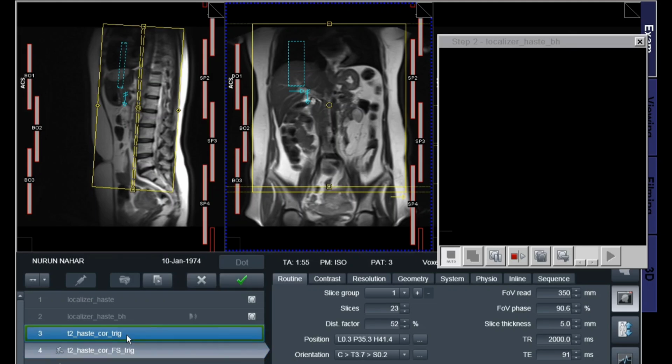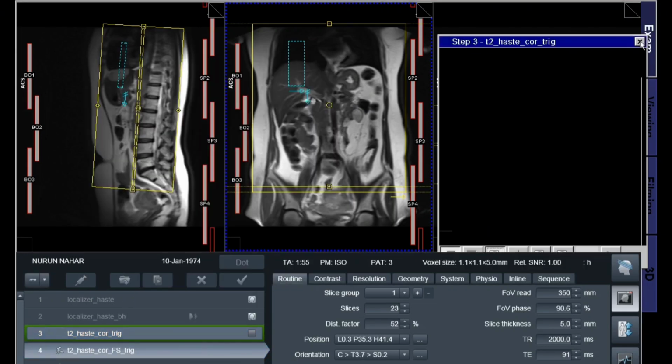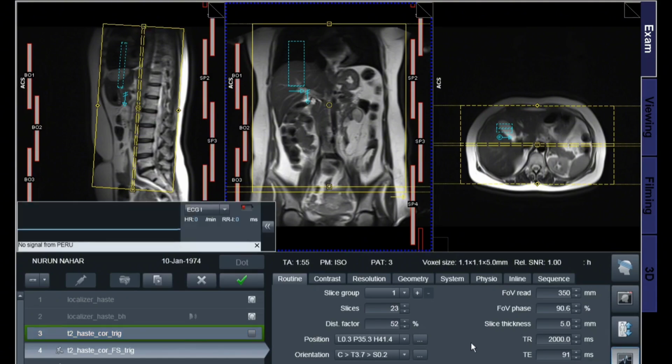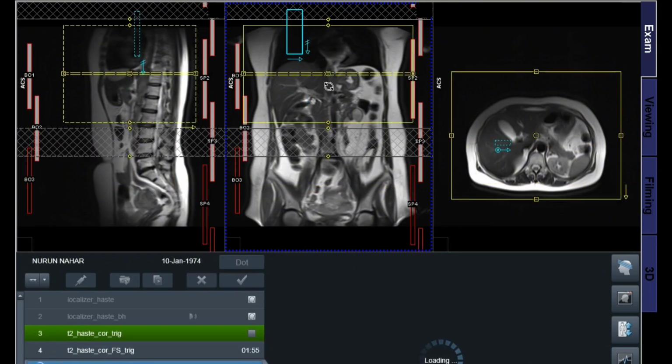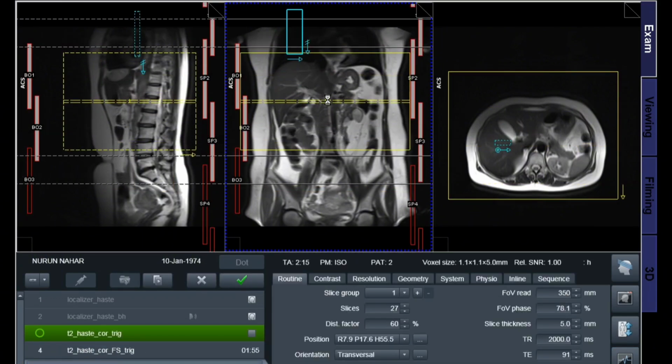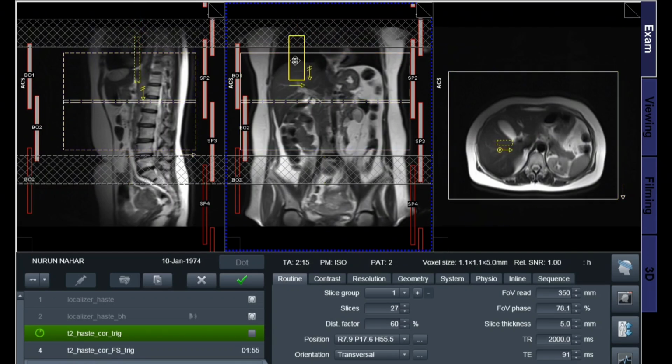What is MRI HBS? MRI HBS is a non-invasive imaging modality used to evaluate the liver, gallbladder, bile ducts, and pancreas. It uses strong magnetic fields and radio frequency pulses to produce high-resolution images without using ionizing radiation. MRI HBS is especially helpful for soft tissue characterization and biliary tract evaluation.